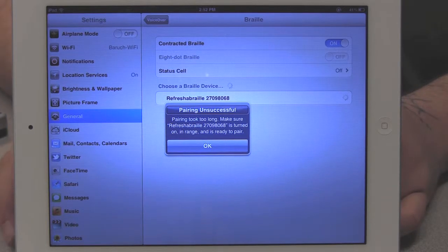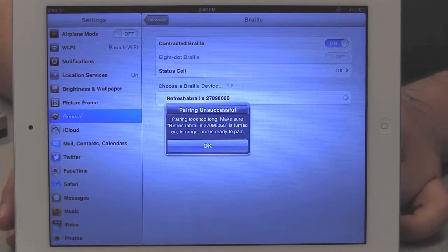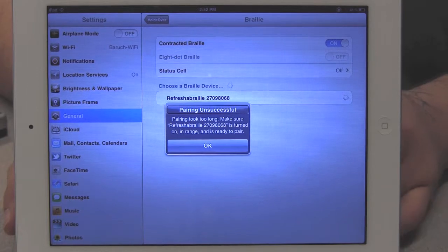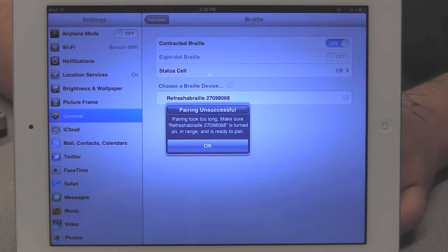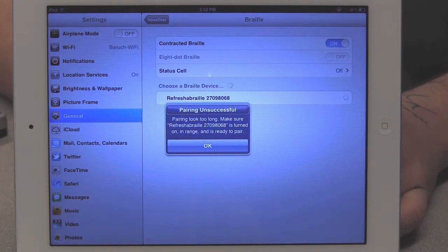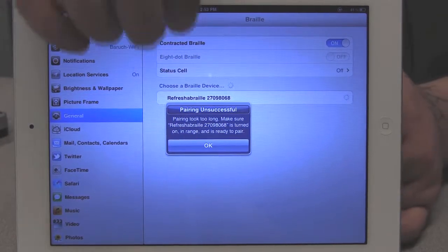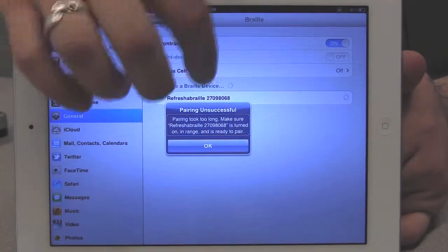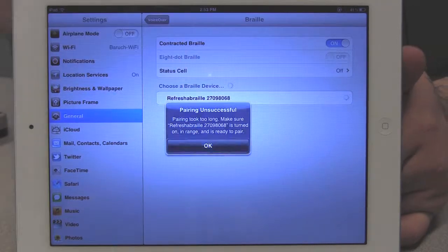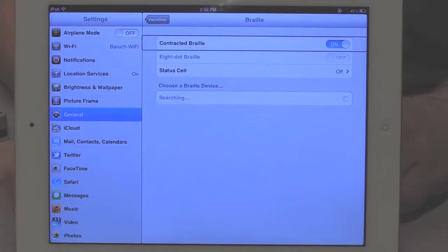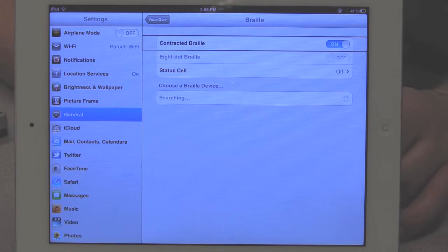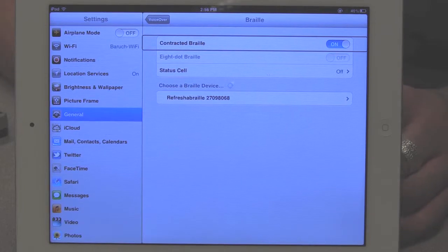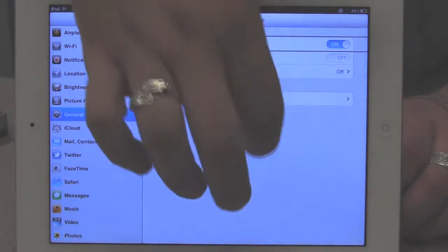One thing, obviously, that we need to note here is that the pairing process is actually timed by the device. So if you do take too long, it's going to say that you were unsuccessful, and then you have to begin the whole process again. So I'm just going to dismiss this window by going to the OK button. Now, if you have too many failed attempts at trying to pair the two devices, you might have to reboot your computer to reinitialize the pairing. And I just did that. So we're going to go back to the list.